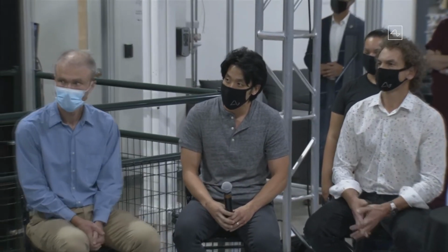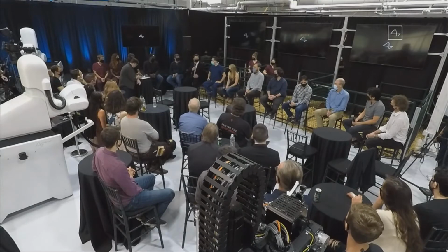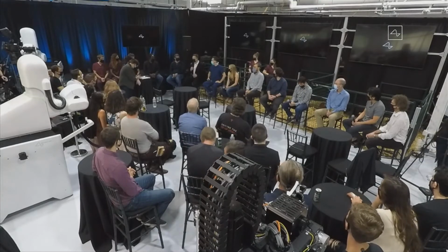And for making sure that our implant is low power, we're actually running them at a very slow speed. And then for stimulation, we can create any arbitrary waveforms with about 7 microsecond resolution. So basically, whatever you want to draw, we can stimulate and generate those pulses through any combination of our electrodes. And this is just version 0.9, or aspirationally version 1. As we go to version 2, 3, 4, these things will expand, ultimately by many orders of magnitude.